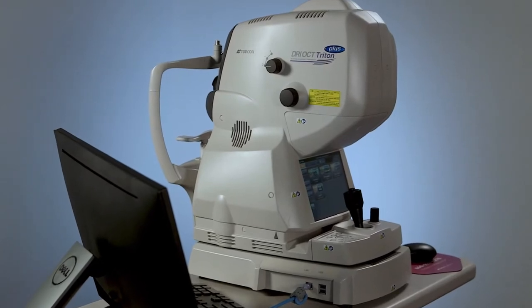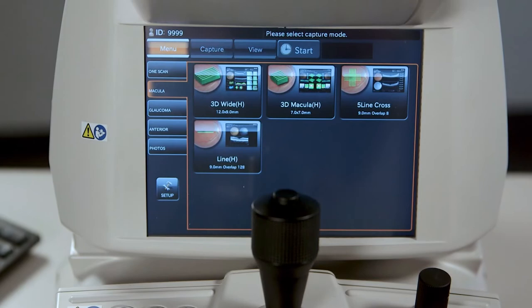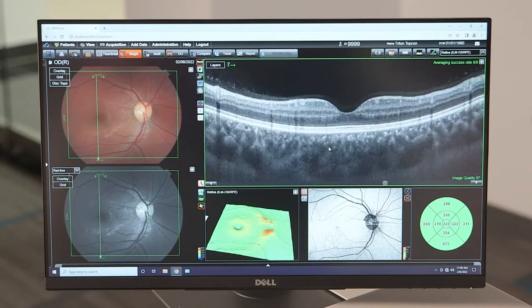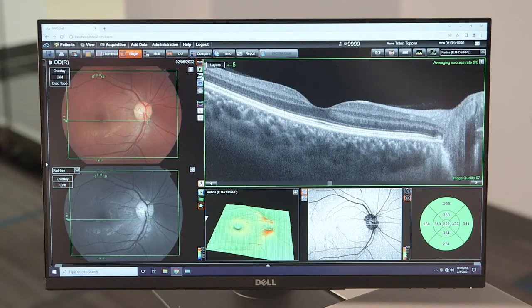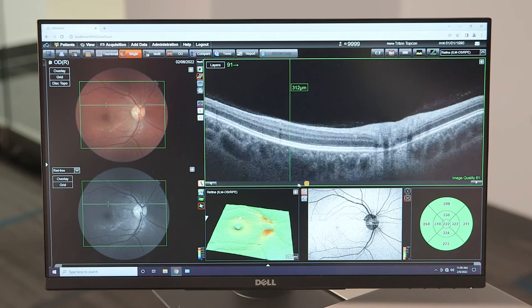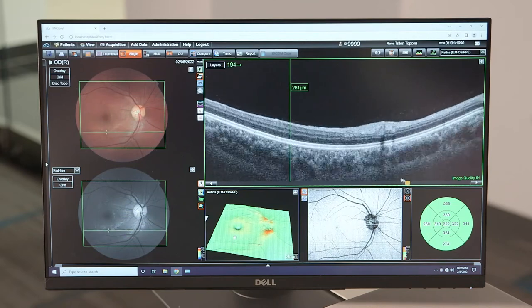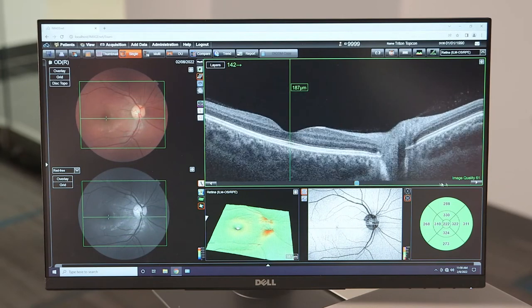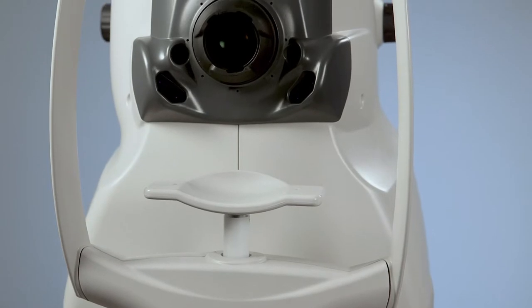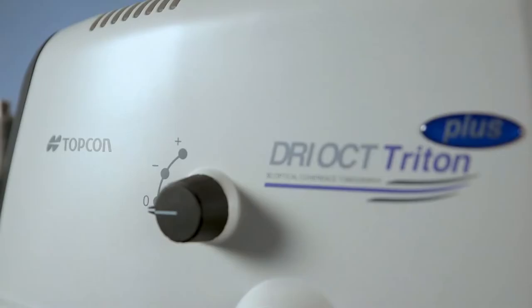The Triton swept source OCT fundus camera is the fast multimodal OCT that allows for visualization into the deepest layers of the eye, even through cataracts and other media opacities. Its 100 kilohertz scan speed helps capture detailed images from the vitreous to the choroid in a single scan. Triton's invisible scan beam technology results in fewer motion artifacts and fewer re-scans, thereby improving your practice's efficiency and the patient experience.